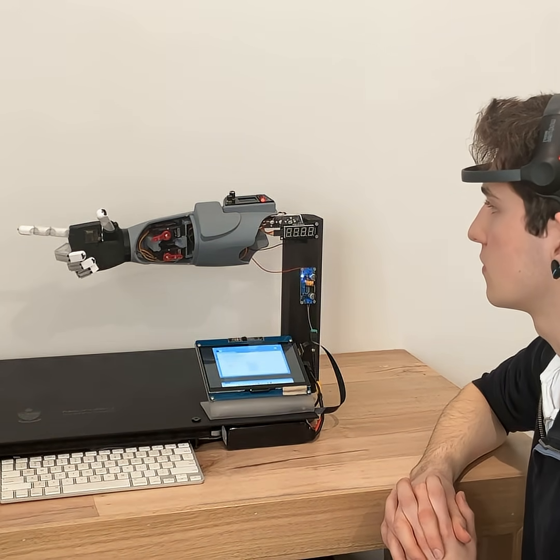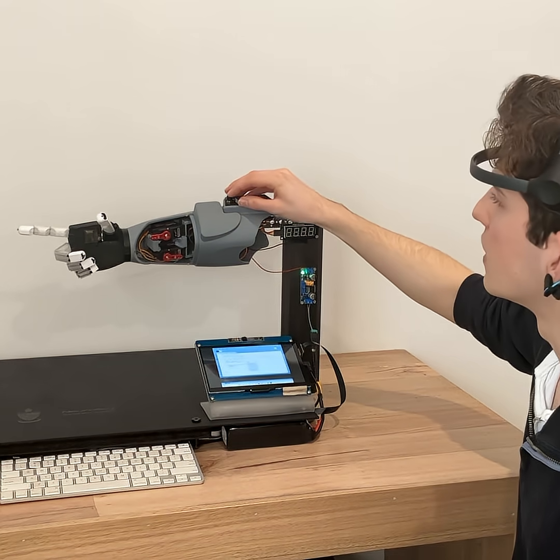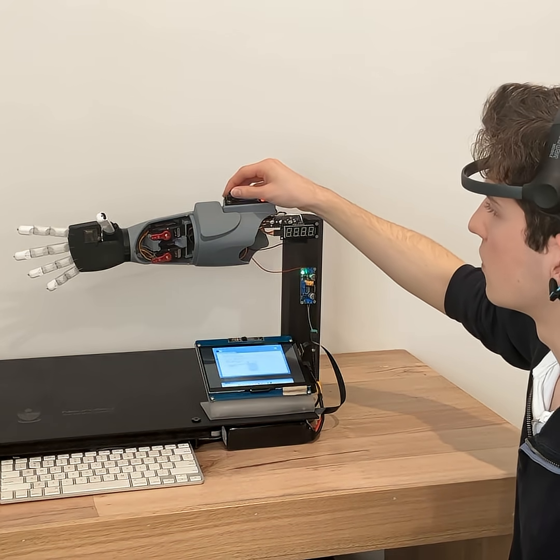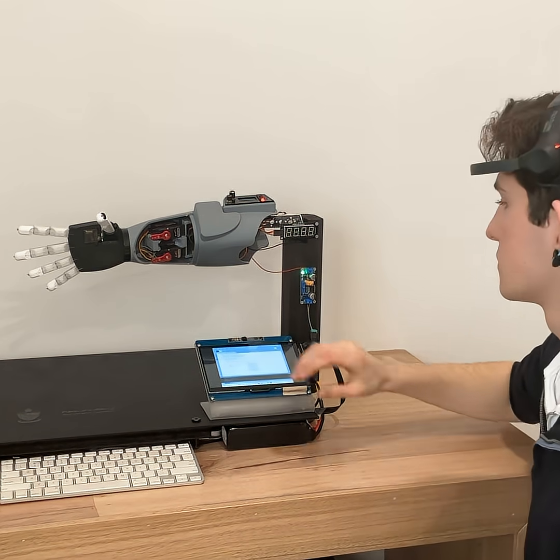Three, two, one. And then back into mode one where it's just controlled entirely by the brain again. Thank you.